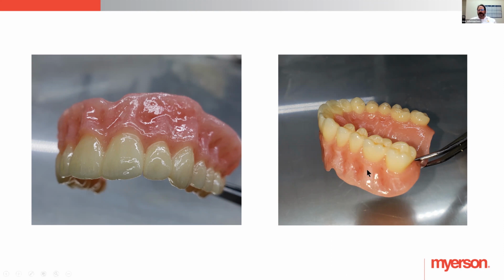And you can see here a little bit of the pale, a little bit of the dark red, a little blue in the incisal, a little coloring around the neck. You can see how the OptiGlaze will fill that interproximal, so you get that depth of look, but it's clear, so that's why you're seeing a lot of that.